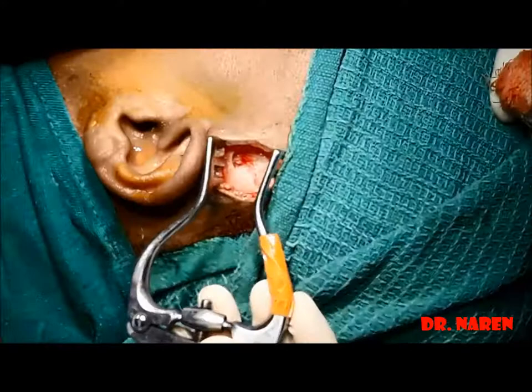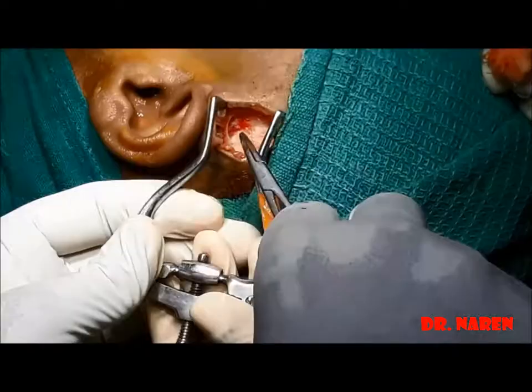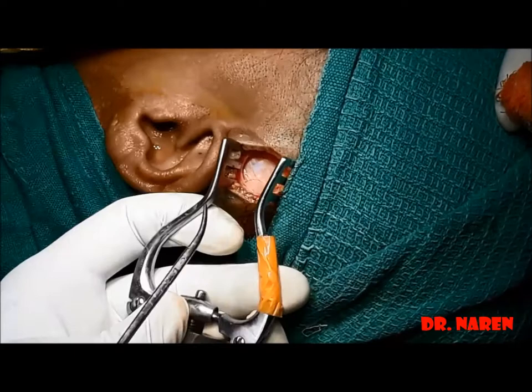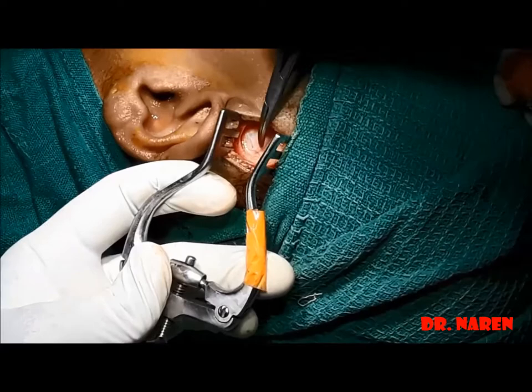The self-retaining retractor can be reapplied again for dissecting the deeper parts. The next layer we are going to dissect is the temporal fascia. The temporal fascia is composed of two layers: the superficial layer, which is just beneath the auricular muscles, consisting of loose areolar fibrous tissues.